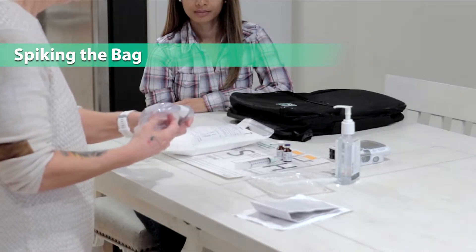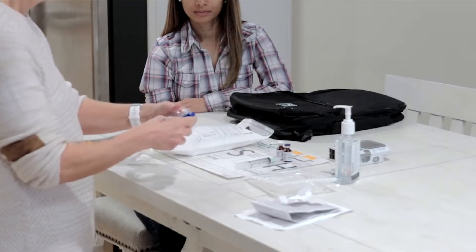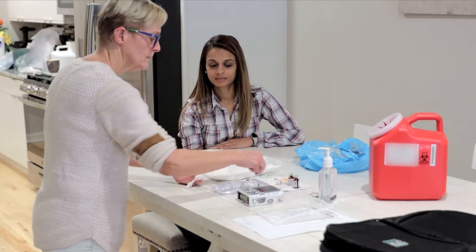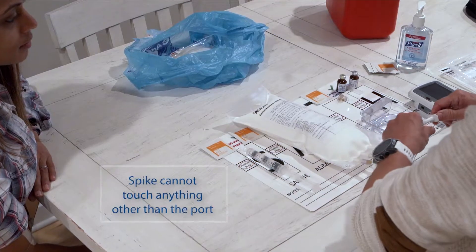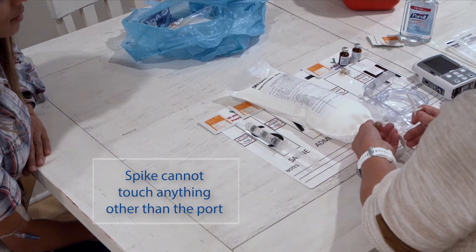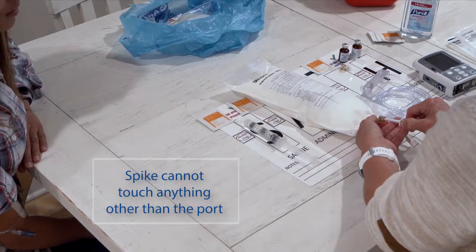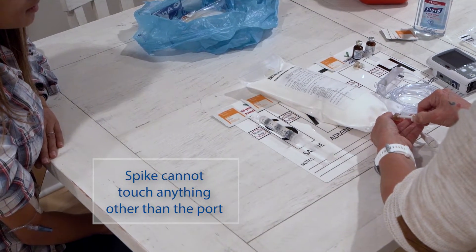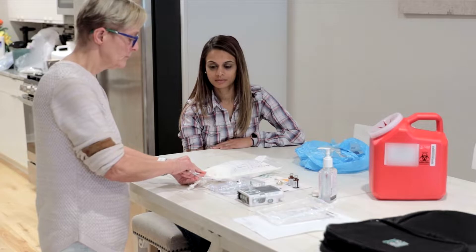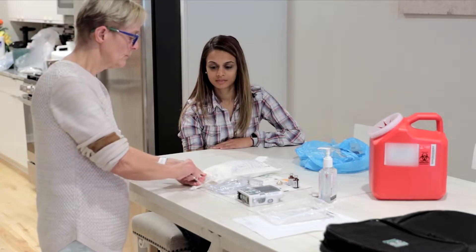We will now spike the bag with the tubing. First, remove the tubing from the package. Unwind and remove the color clip from the cassette. Remove the plastic protective tab from the TPN bag, then remove the clear protective cap from the spike on the TPN tubing. Make sure the spike does not touch anything other than the port on the medication bag, such as the counter or your hands. If the spike touches anything besides the port, throw the tubing set away and begin again with new tubing. Insert the tubing spike into the port on the medication bag where the tab was removed, using a push and twist motion — like trying to open a locked door. You will know the bag is spiked when you see the tip of the spike inside the TPN fluid.